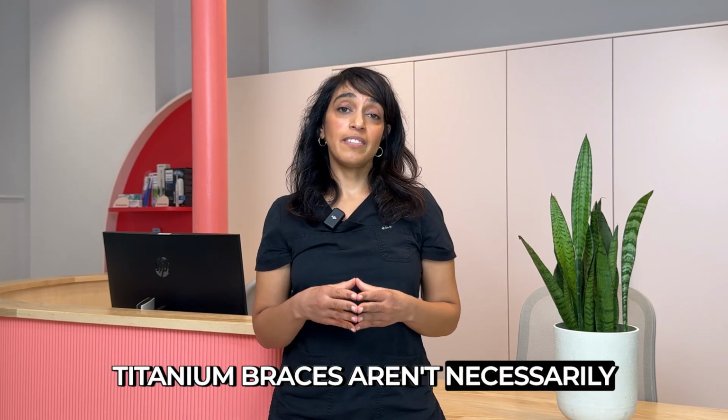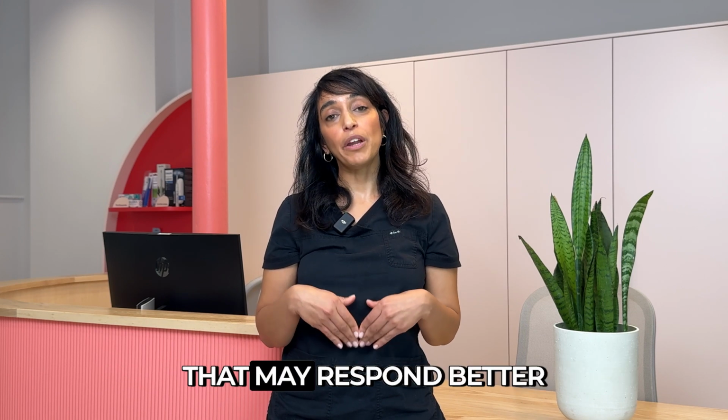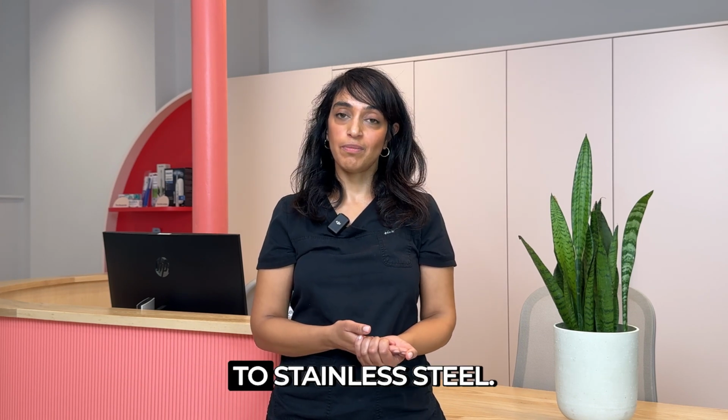Titanium braces aren't necessarily better than stainless steel braces. However, there are a few individuals that may respond better if you're allergic to stainless steel.